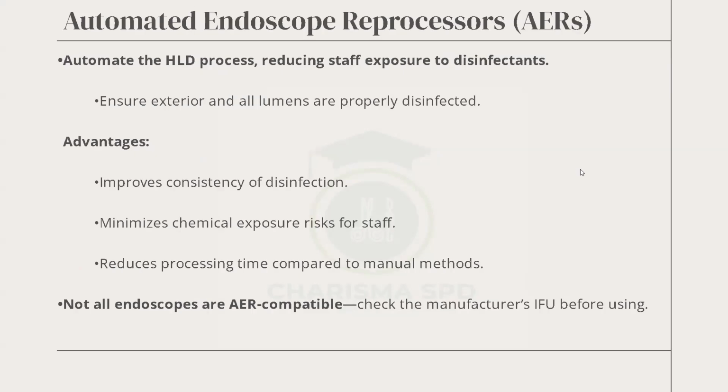Now, if the endoscope is supposed to be processed through an automated endoscopic reprocessor, it makes the work easy. Labor, your strength, your expertise is eliminated. You only need a good job from decontam, and then the rest will be taken care of by this machine. You still have to connect the right tube to the right channel. If you mix it up, you damage it. So you have to be in-serviced.